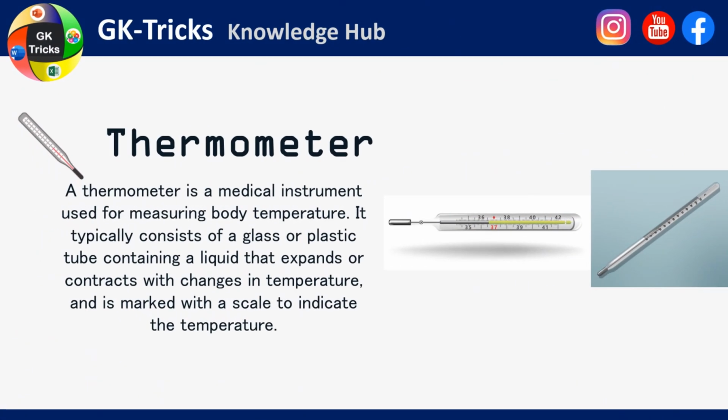Thermometer. A thermometer is a medical instrument used for measuring body temperature. It typically consists of a glass or plastic tube containing a liquid that expands or contracts with changes in temperature, and is marked with a scale to indicate the temperature.